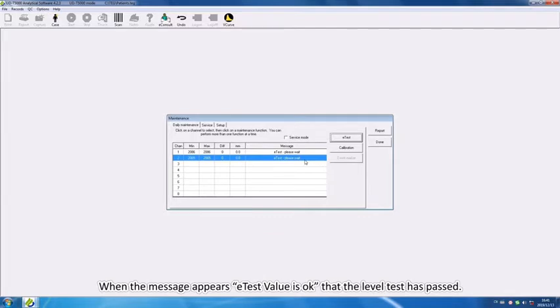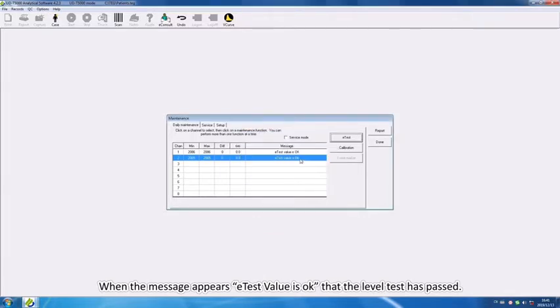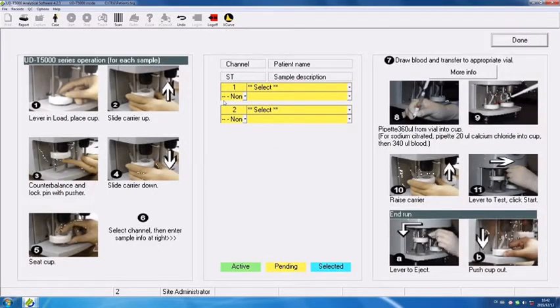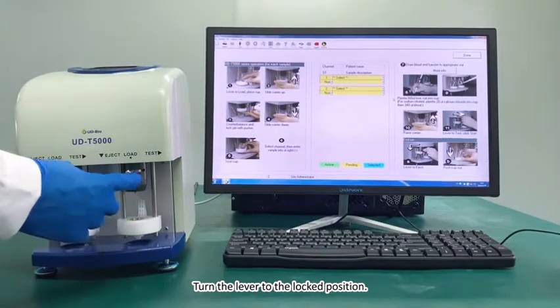When the message appears that the E-test value is OK, the level test has passed. Turn the lever to the locked position.